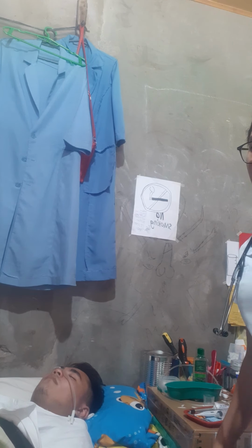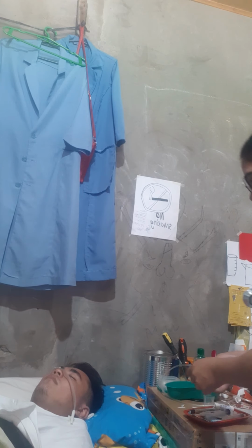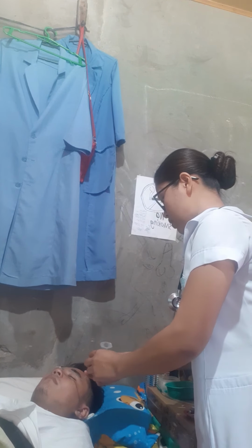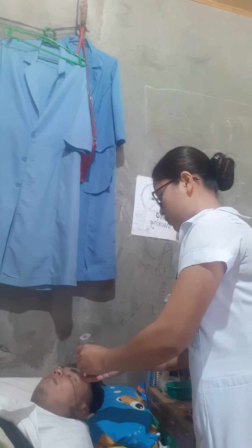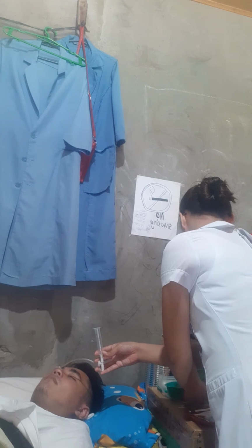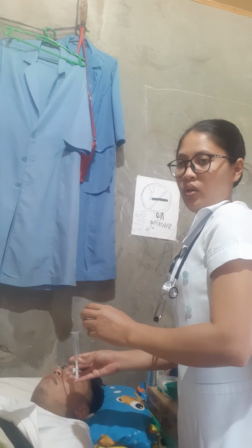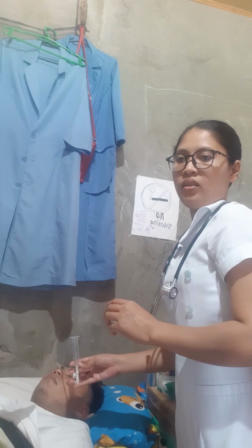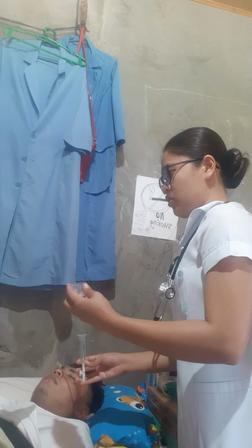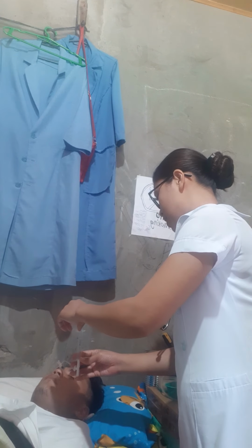Next, for a syringe open system, we need to remove the plunger first, then connect. After connecting, we need to clamp it, so that when we place the feeding, it will not go in directly, because quickly administered feeding can cause flatus, cramps, and or vomiting for the client. The measured feeding is then placed in the syringe.